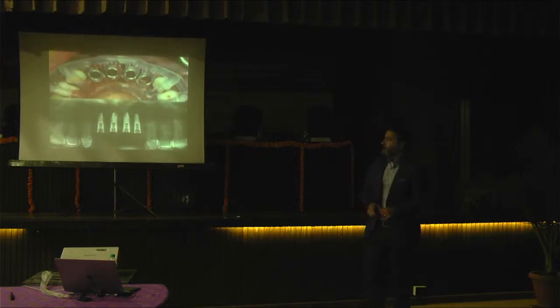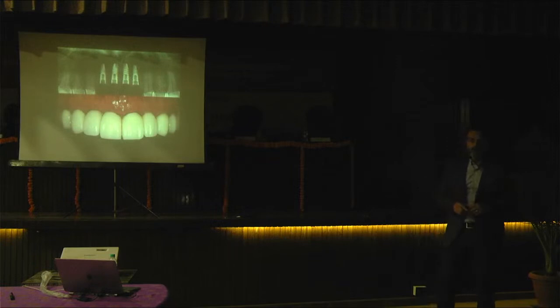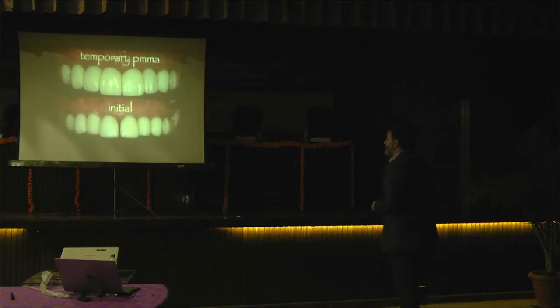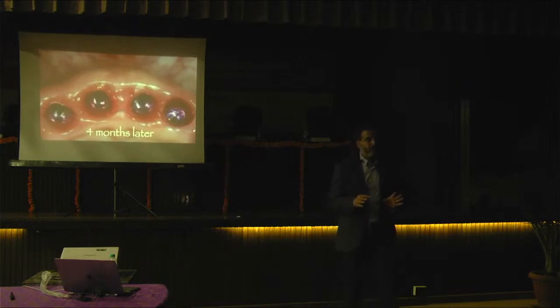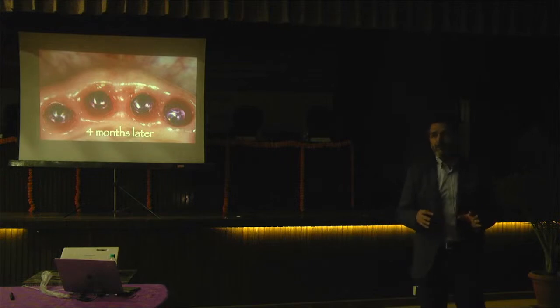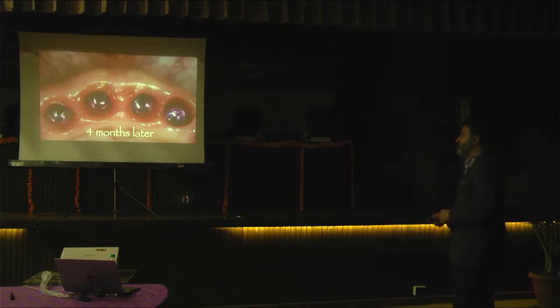Then, placing the implants, and after it, if you had the good torque with the primary stability, you can finalize it with PMMA temporary crowns and finish this way. This is temporary. And after waiting for 4 months, the implants are so healthy and the soft tissue is so healthy around the implants and the neck of the implants.